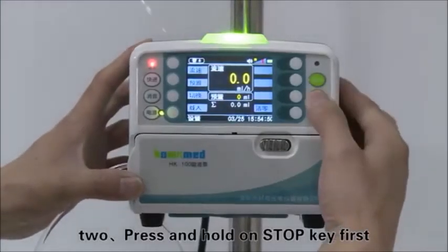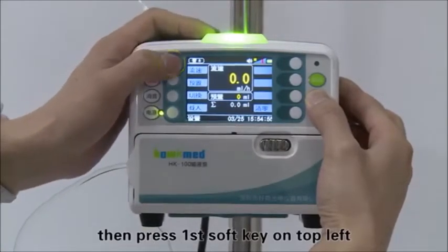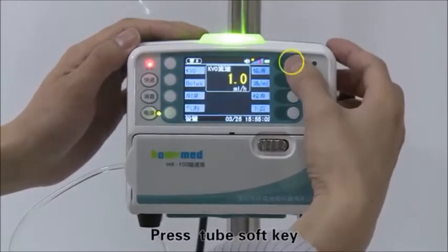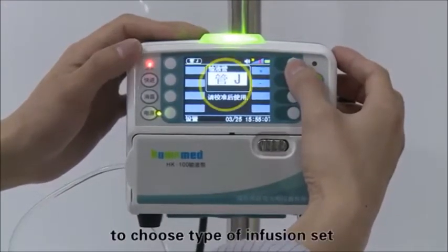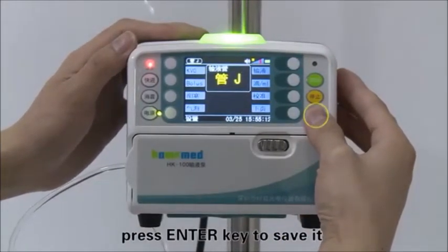Press and hold the stop key first, then press the first soft key on the top left to enter the parameter setting interface. Press the tube soft key, then use the plus or minus key to choose the type of infusion set. Press the enter key to save the selection.